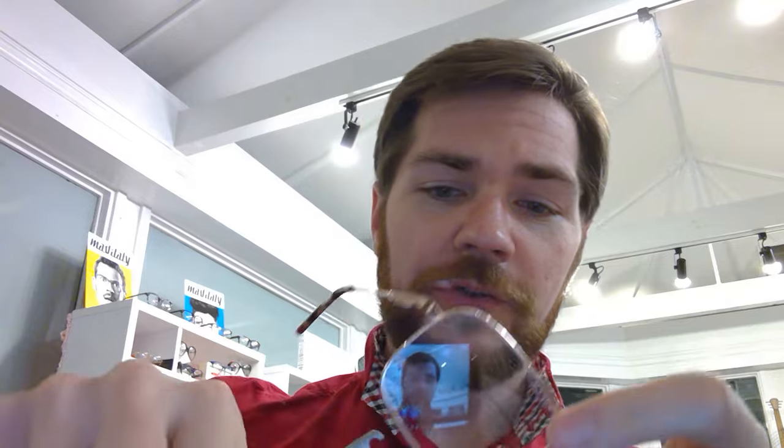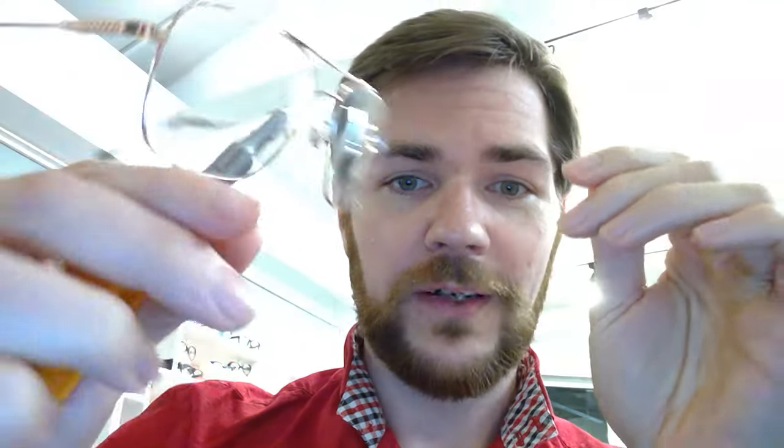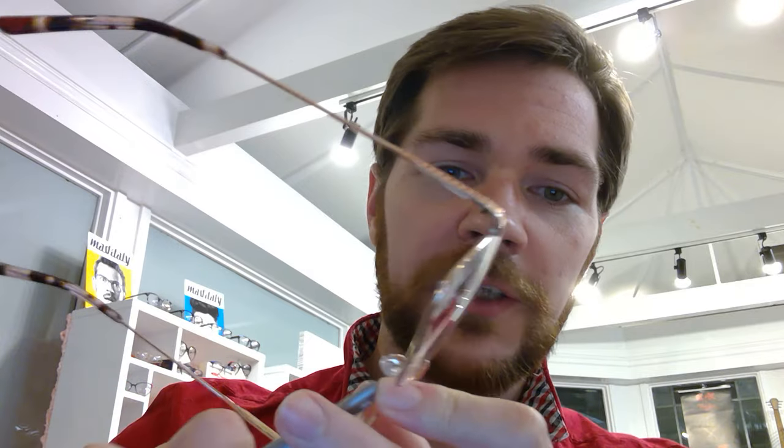This is sitting super close and super down low - you can see it's even hitting on the cheeks. With a very simple adjustment we can fix that. The pliers I use are actually cut out here a little bit, which works really well because it just sits down right over the pad arm and fits really well. You don't have to worry about scratching lenses or any bad things like that. We're gonna bring these in a little bit, which is gonna raise the glasses up, and bring them out just a hair as well.